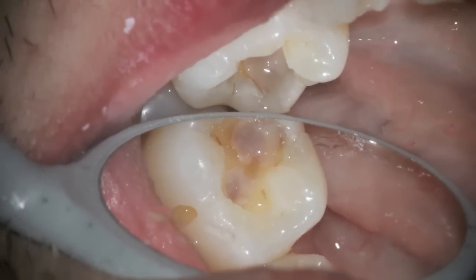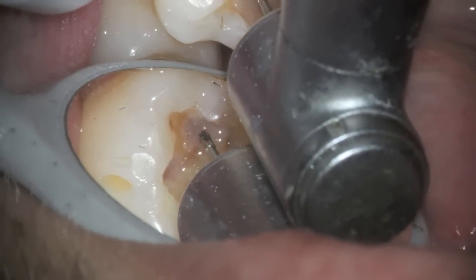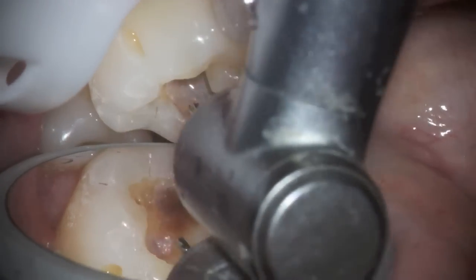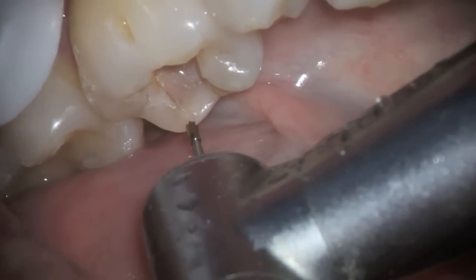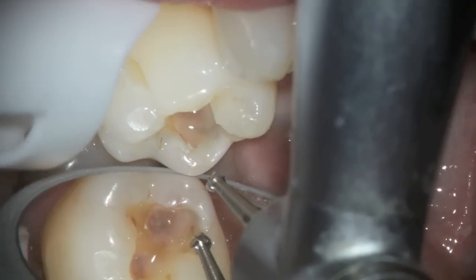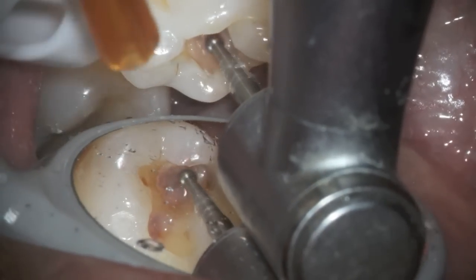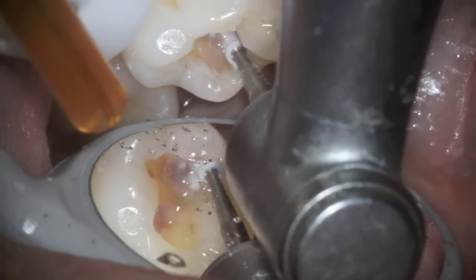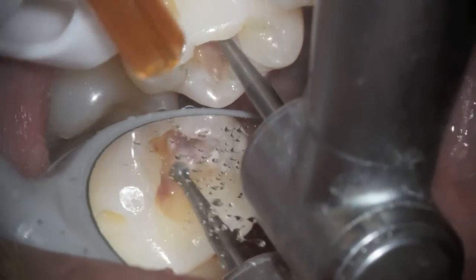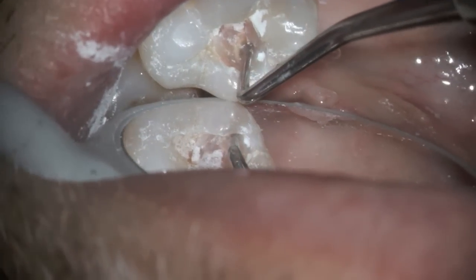Later on in this video you'll see that we spent a fair amount of time. That whole corner where I'm drilling right now is full of tooth-colored material. It gets undermined, and we'll actually see a stress fracture — that whole cusp is undermined. We go ahead and start removing. Sometimes using a very slow-speed handpiece will allow you to get a much better idea of where the composite is.